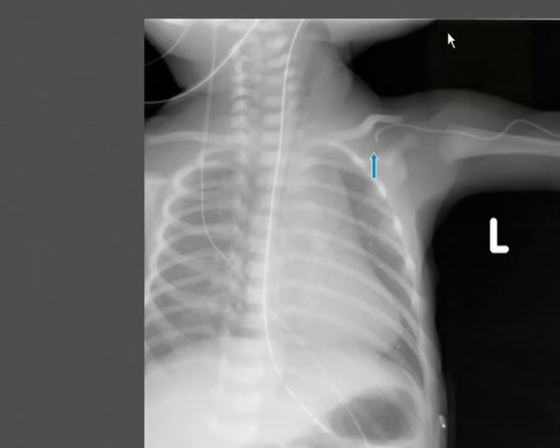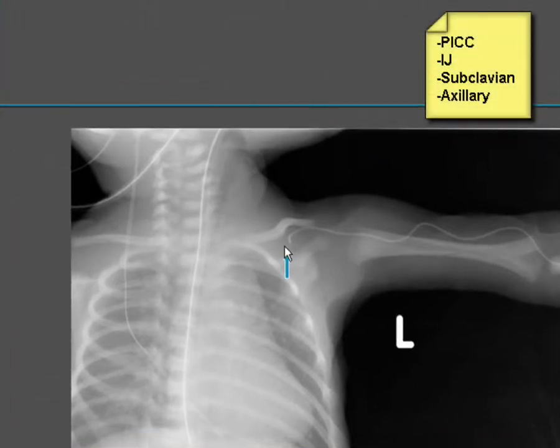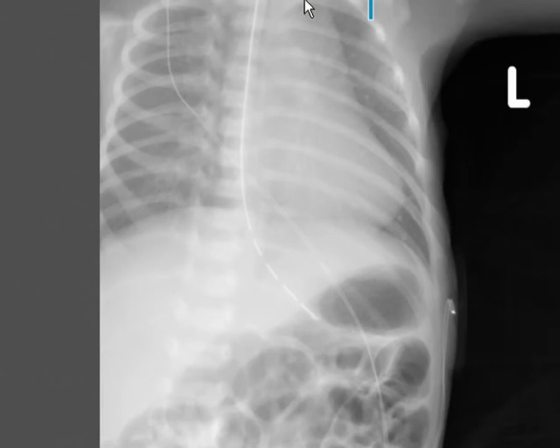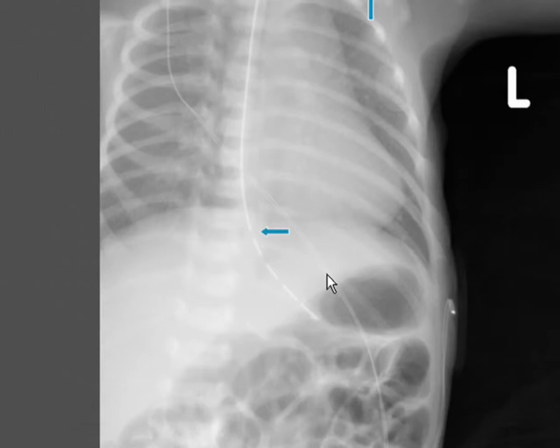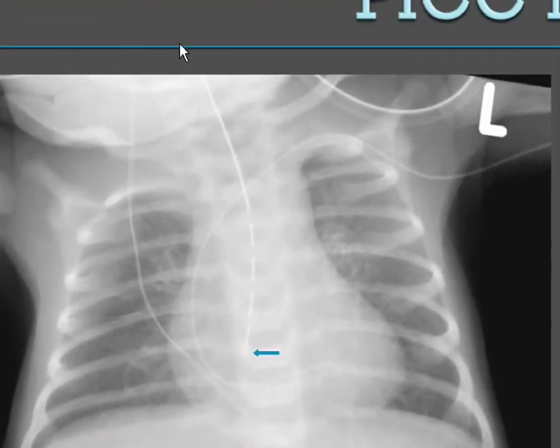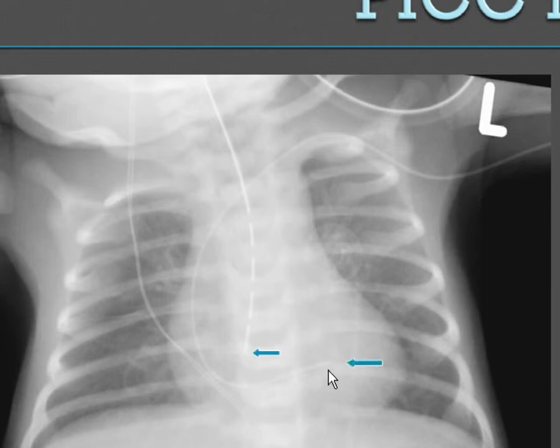Aside from PICCs there are other peripheral lines like axillary lines and subclavian lines. Subclavian lines course under the clavicle whereas IJs come down from the neck. In kids, the neck is so short that it can be hard to distinguish an IJ from a subclavian line, but the subclavian will go under the clavicle. Also note that the proximal side port here is a little high towards the GE junction and should be advanced slightly. This PICC goes too far into the right ventricle. Also, this oral gastric tube isn't coming down far enough — it's either in the mid-esophagus or could be in the trachea.